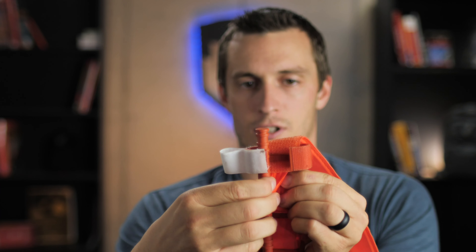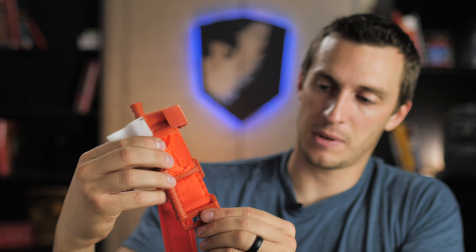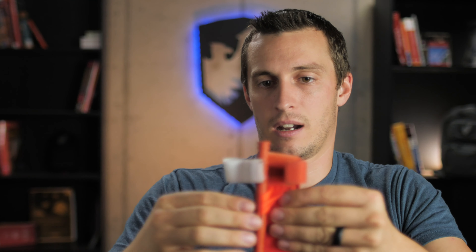Take the tourniquet all the way out and we're just going to start from having it completely undone so it's easy to follow along. The windlass — make sure you've got a little bit of slack in the windlass because it's going to get slid over to one side, and we're going to pack the rest of the tourniquet right here so it fits up underneath this plastic clip. The windlass is not actually making it any thicker, so windlass off to one side and the rest of the tourniquet off to the other side.